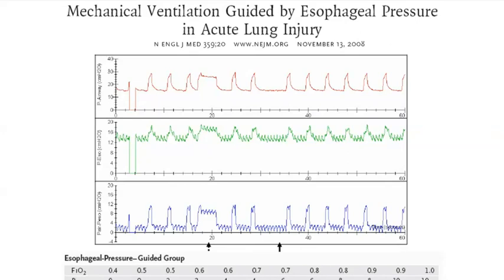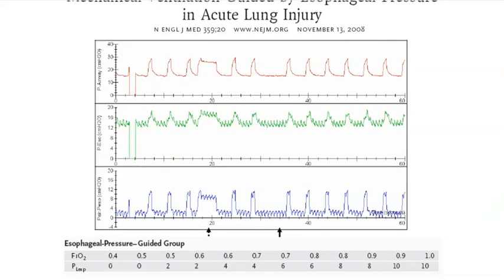And I think this makes a lot of sense. And again, because I've showed you that we have validated the reliability of these measurements. However, it's only pressure at mid-chest, which makes sense also because this is probably where you have the higher risk of opening and closing of the lung. So the rationale of this approach, I think, makes sense, but we certainly need more clinical validation to be sure this should or might be applied in every patient.